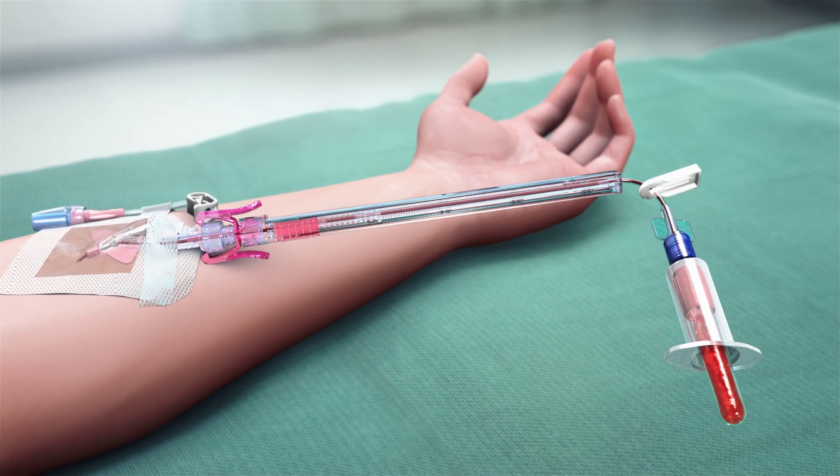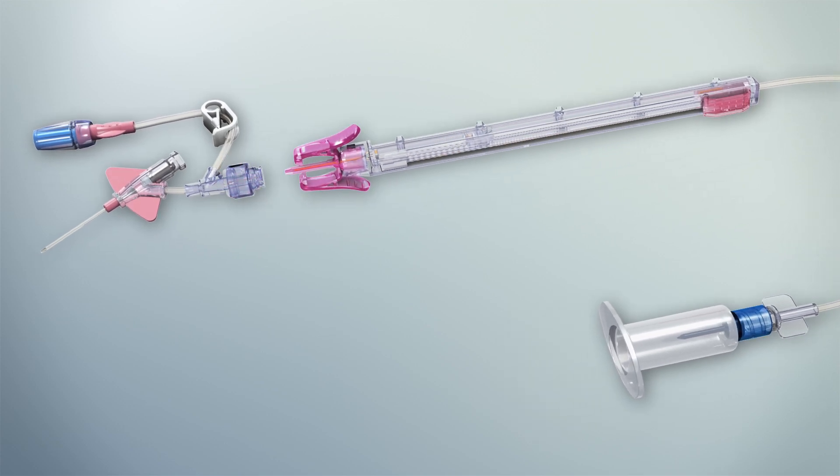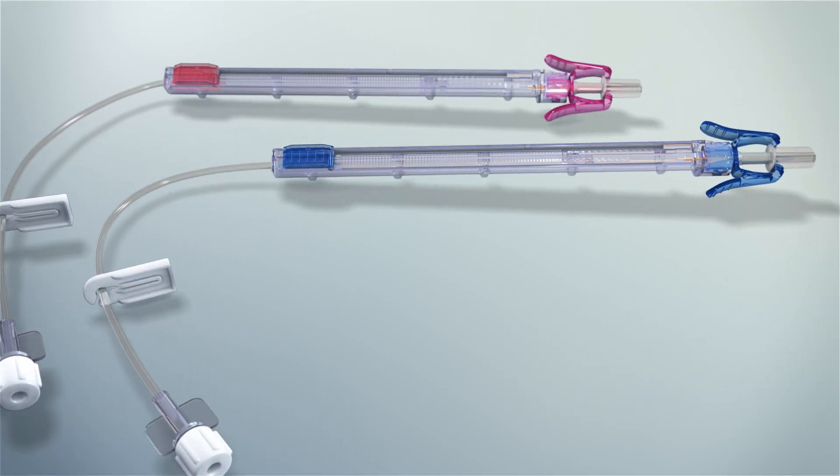Evacuated tubes or syringes are then connected to the device for collection. After collection, the PIVO Pro Blood Collection Device is disconnected and discarded.